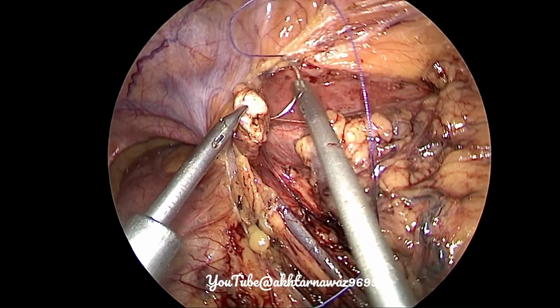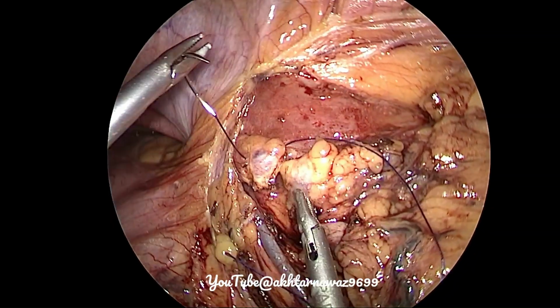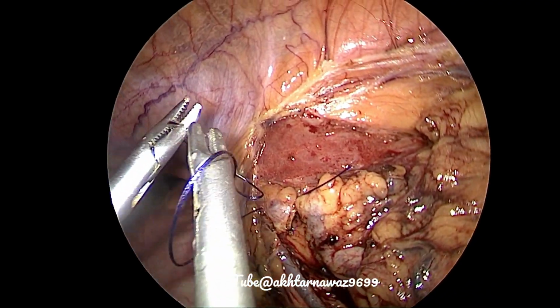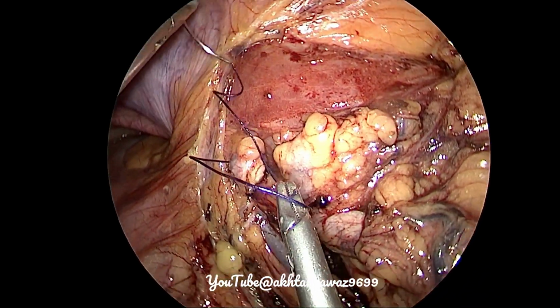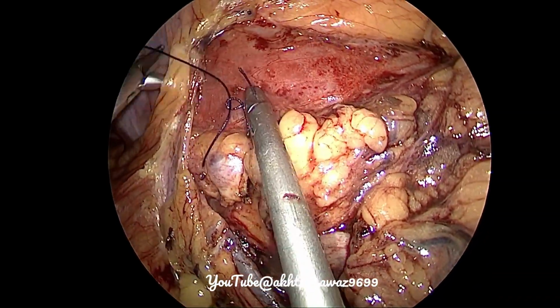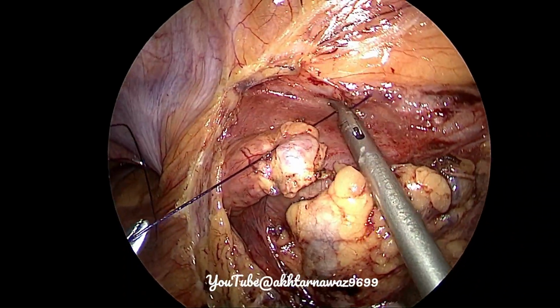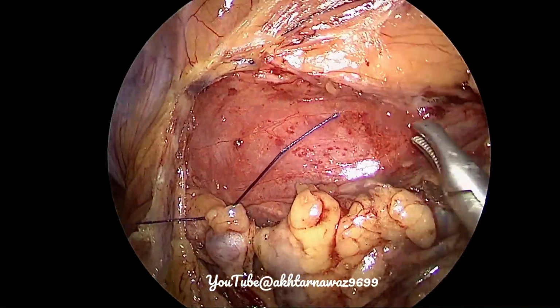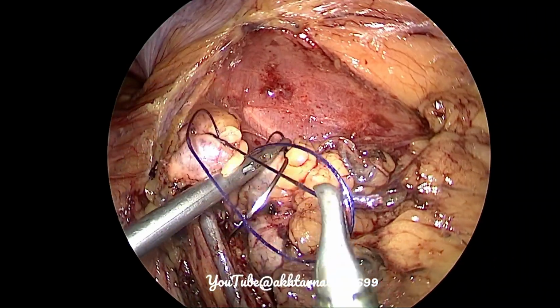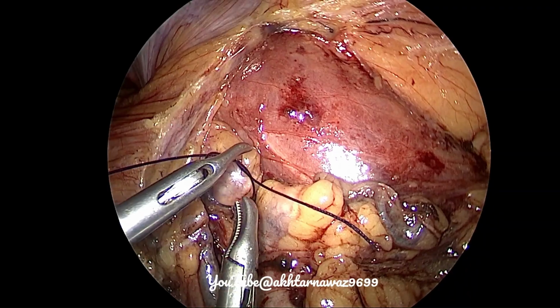So a 2-0 Vicryl is used for transfixation. Because the lumen was visible, that's why we applied this suture. Otherwise, it may not really be necessary to clip the distal end.